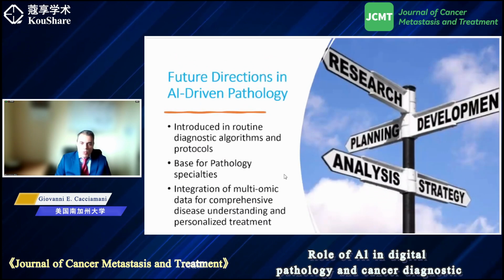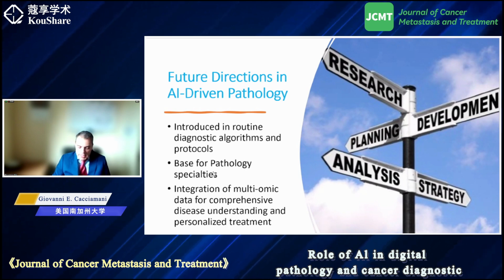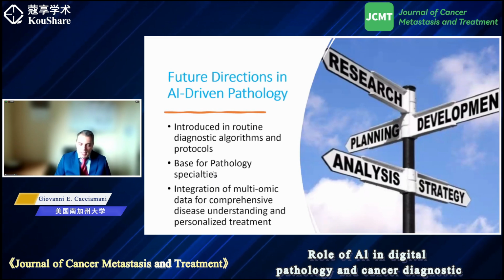Indeed, this is quite important in my view, because not only could digital pathology be introduced in the routine pathology workout, but this can be the base for pathology specialties. You know that surgeons and clinicians are divided. We have cardiologists, we have thoracic surgeons, yet for pathologists, in a large part of pathology departments, we have general pathologists.